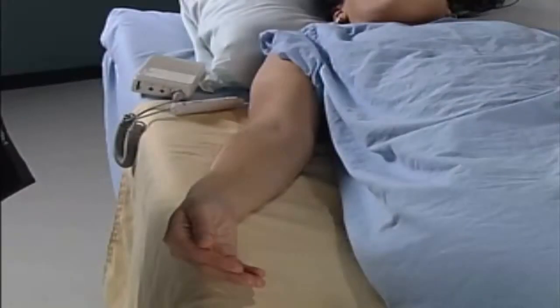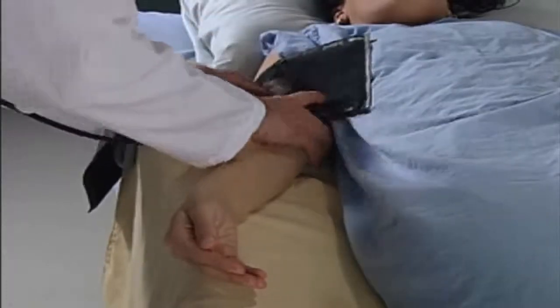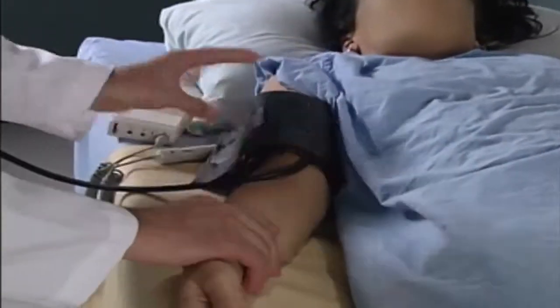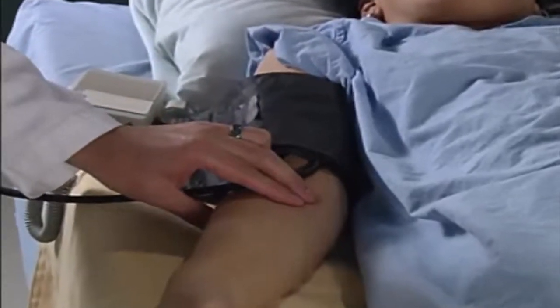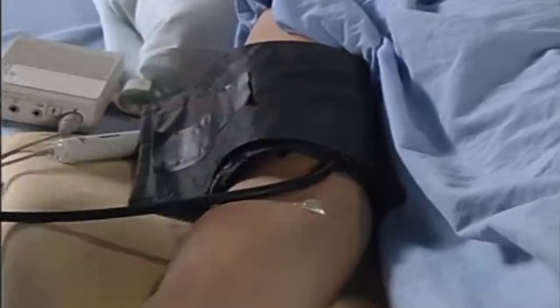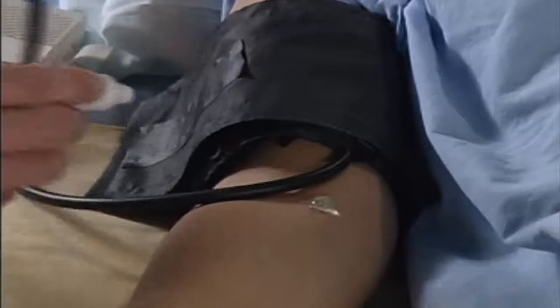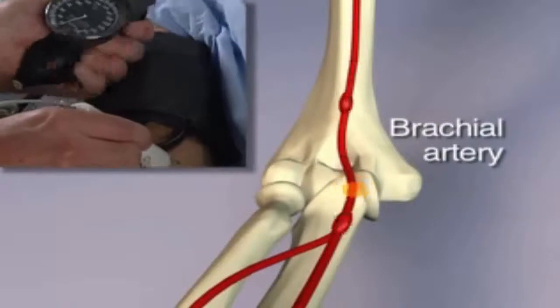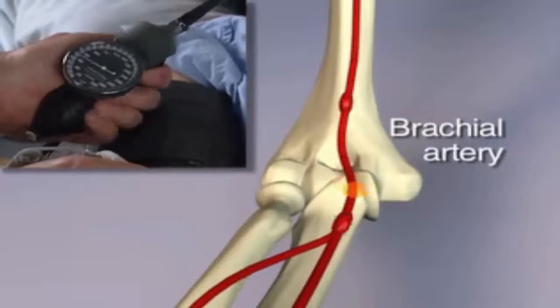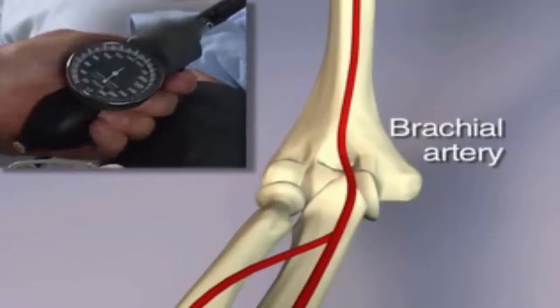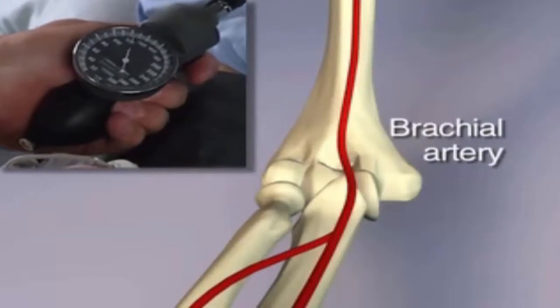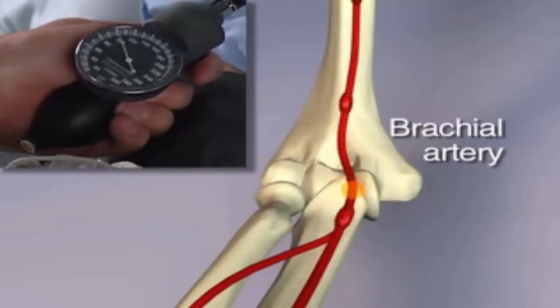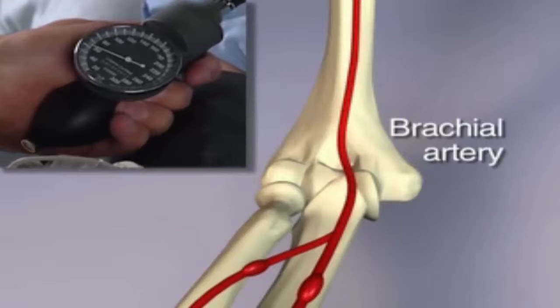To measure the ankle brachial index, you will first need to measure the arm blood pressure with the Doppler probe. It is important to choose a sphygmomanometer cuff of the appropriate size. This is placed over the upper arm. Palpate the brachial pulse and apply gel with the probe at the site where the pulse is felt. Place the Doppler probe lightly on the gel at a 60-degree angle towards the patient's head. Inflate the cuff rapidly until the brachial artery flow ceases with no further Doppler signal, and continue for about 20 to 30 mmHg above this value. Then deflate the blood pressure cuff slowly at 2 to 4 mmHg per second in order to note the systolic value. Wipe the gel from the patient's skin and repeat the procedure on the other arm.